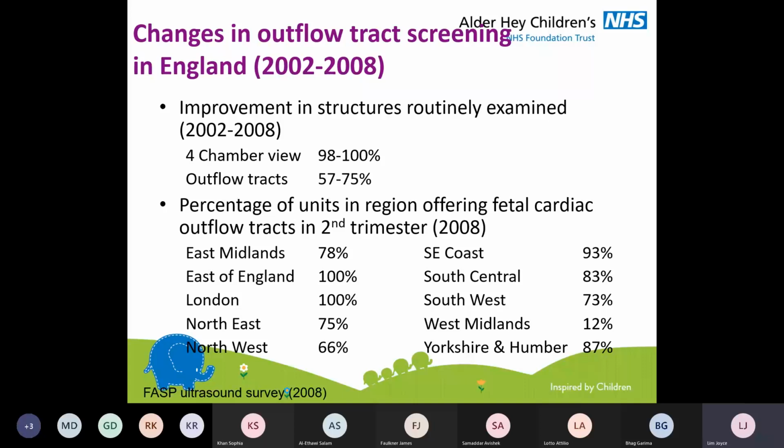as pulmonary outflow. For some structures of the heart, for example, if you have a tetralogy of Fallot, the 4 chambers can look relatively normal if you miss the VSD, but it's actually the outflow tracts that look smaller on the pulmonary artery side. For example, with TGA as well, the 4 chambers may look absolutely normal, but it's your great arteries that look parallel or come out the wrong way.